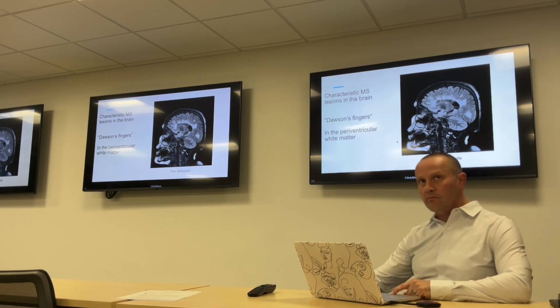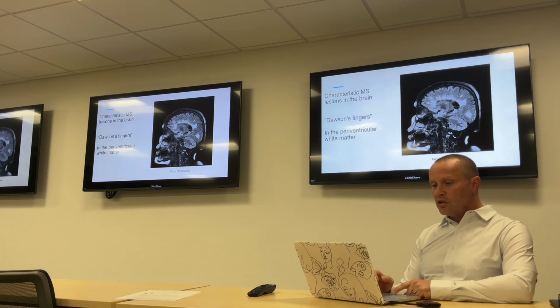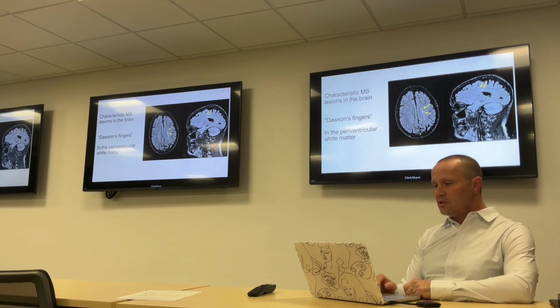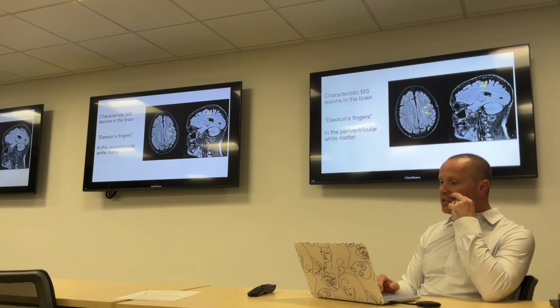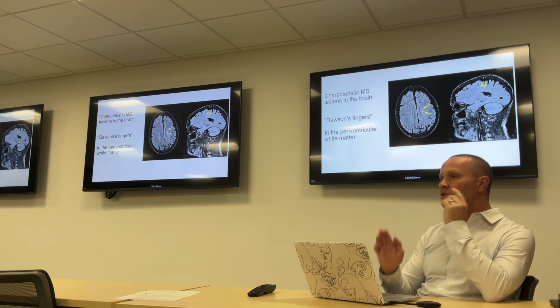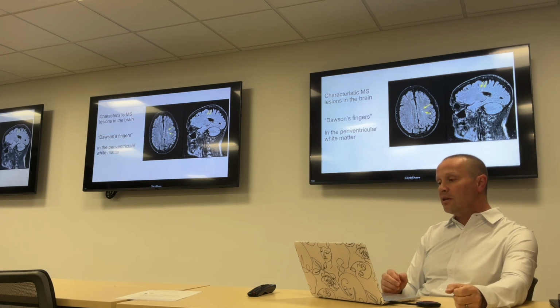I came across a patient last week, I think, this 50-something-year-old guy who had a lot of lesions like this. So I'm just going to sort of show you his lesions are very characteristic kind of lesions in MS. And this is his MRI that I read last week. Not as robust as the last one, but you see how these lesions are kind of ovoid. They kind of extend away from the lateral ventricle on this sagittal picture. Now in the axial plane, when we're cutting a slice right through them, they look like little round dots. But when you look in the sagittal plane, they have an orientation to them. They look different than a microvascular lesion would look.